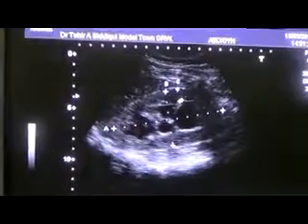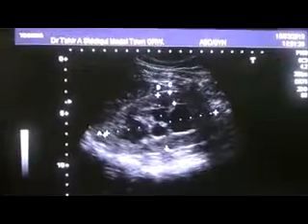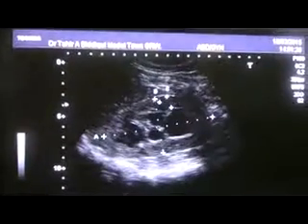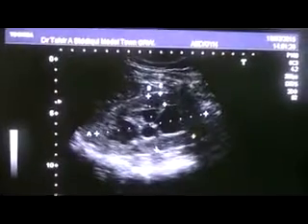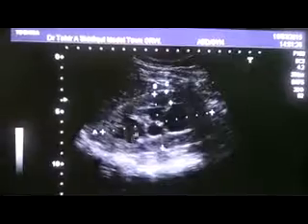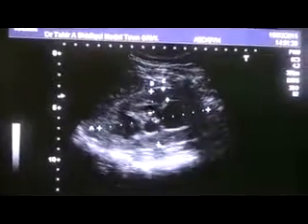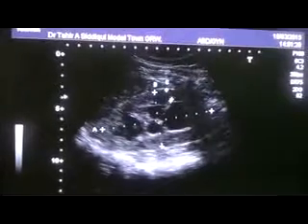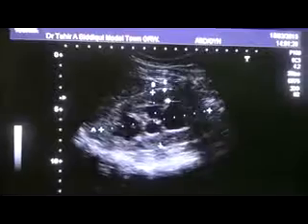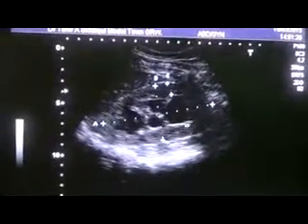This is an ultrasound study of a 20-year-old male, a young boy, focused on the right kidney in longitudinal section in front of you. You see there is dilation of all the calyces, minimal to moderate, with parenchymal thickness measuring 11.2, that is, it's preserved, and the parenchymal echogenicity is preserved.